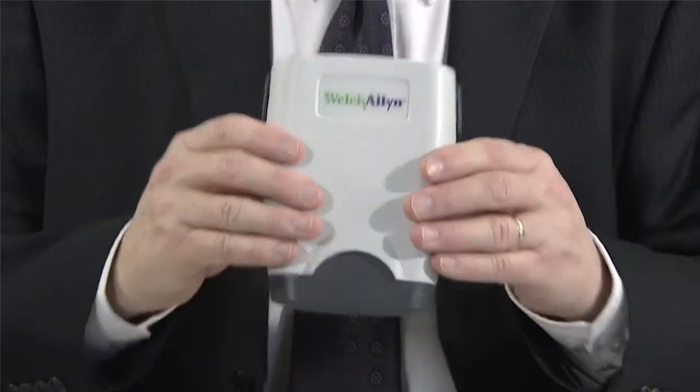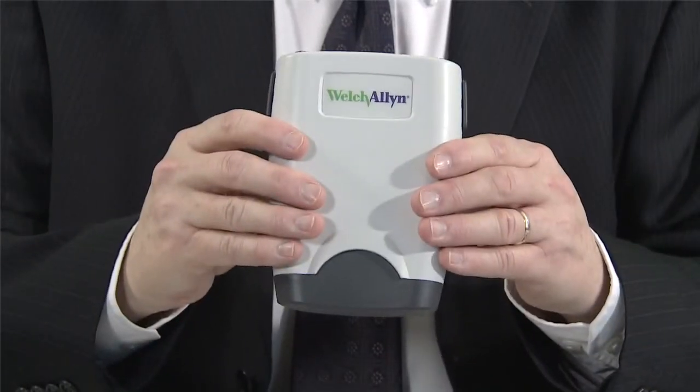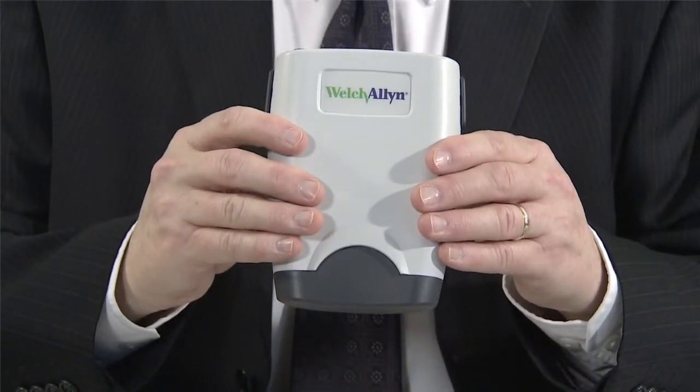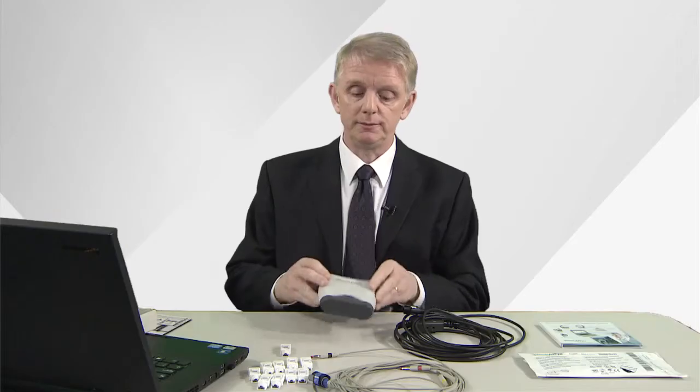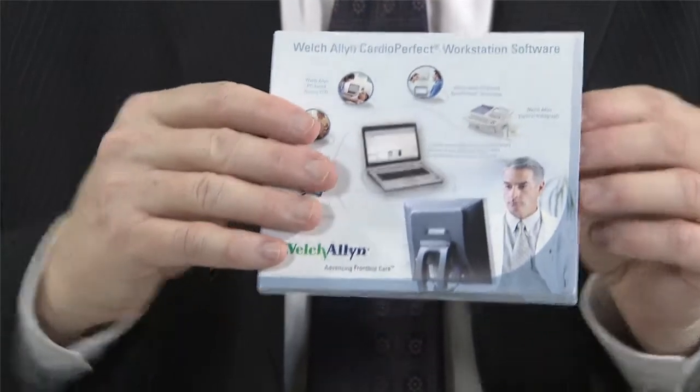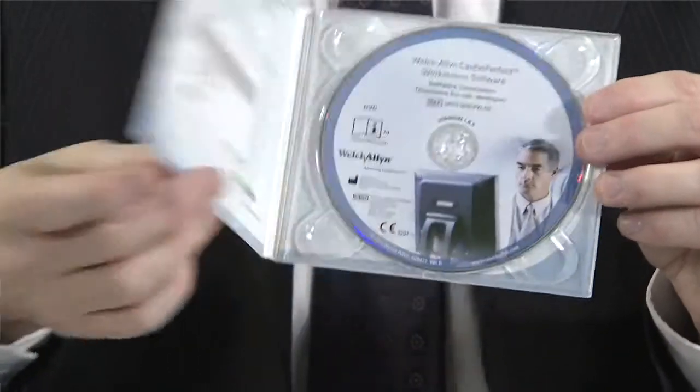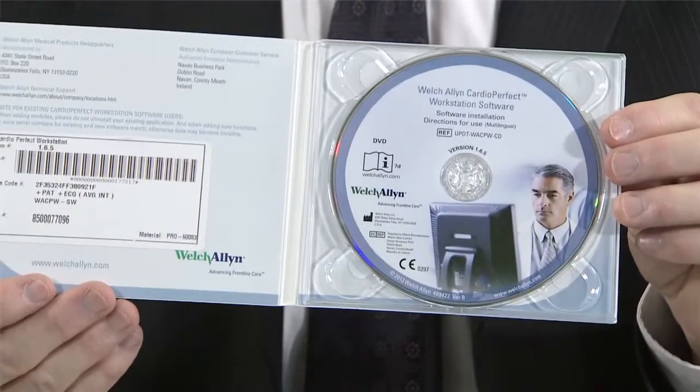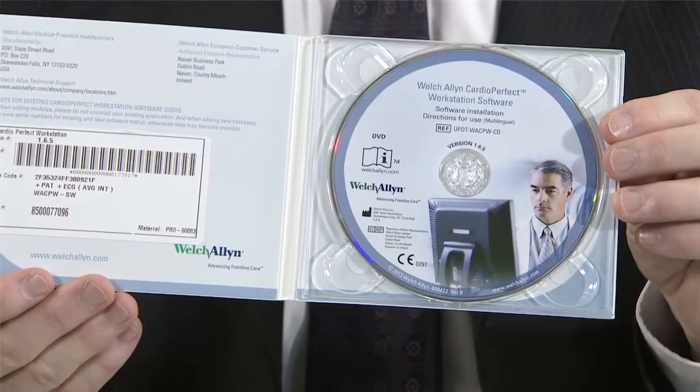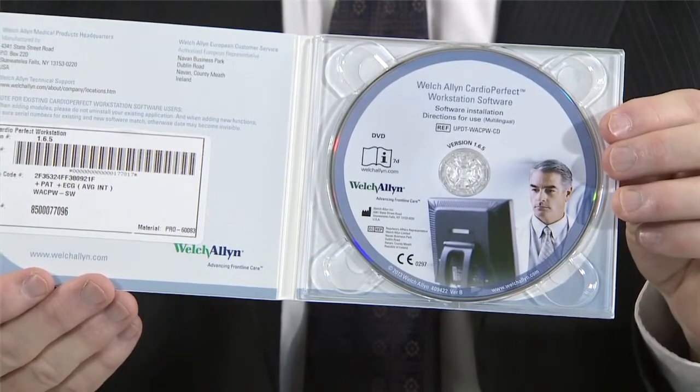But first let's look at the components. When you buy the ECG you get the unit itself, a 5 meter USB cable to connect the unit to the PC or laptop, a patient cable, Welsh Allen software which should be loaded to the PC or laptop on which you're going to do the ECG. A full installation guide is available from your Welsh Allen distributor.